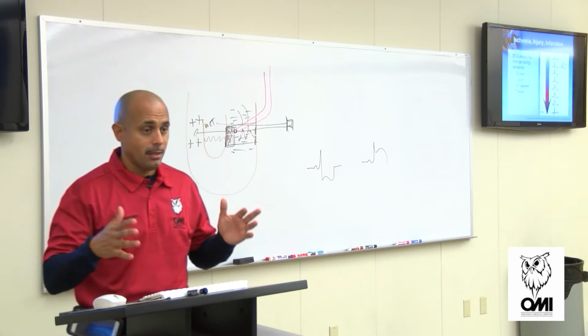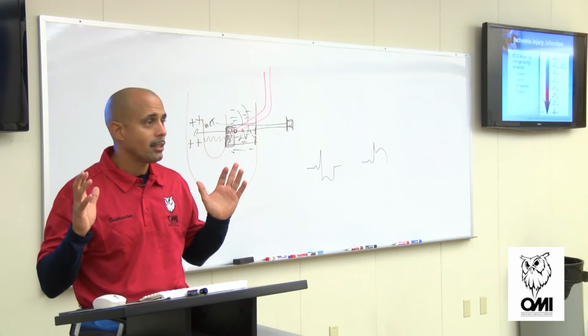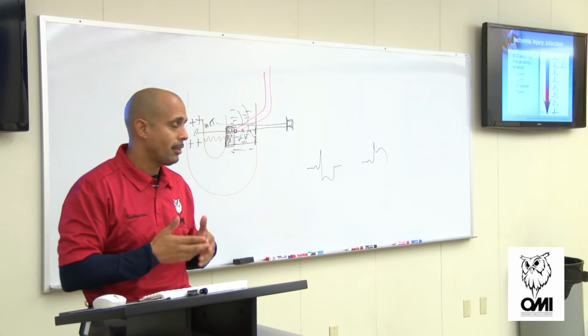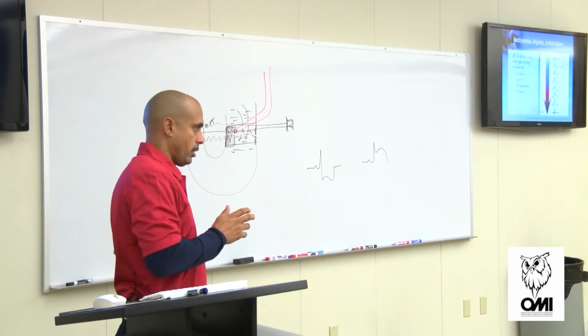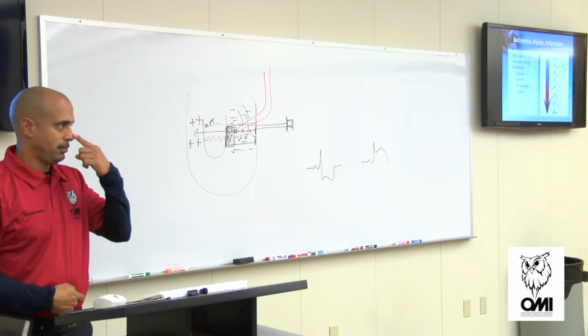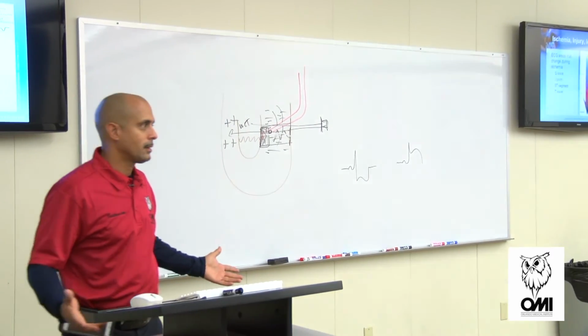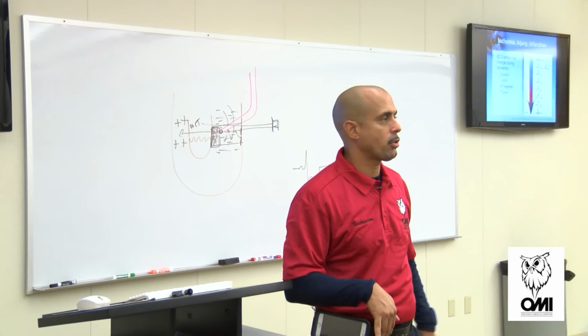And there's a lot of young people that die every day from a heart attack, and they're young, under 50 years of age. So get away from the discrimination. If I got pain from the navel to the nasal, I'm going to do a 12 lead. I'm going to do an assessment. Syncopal episode, all my syncopal episodes get a 12 lead.